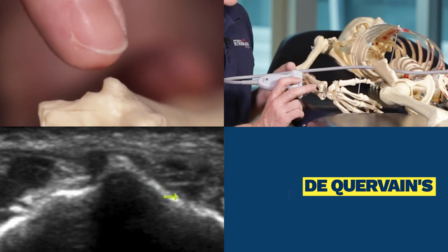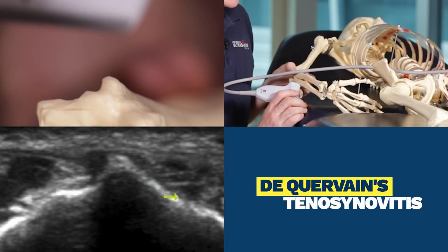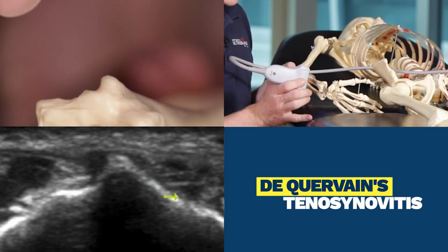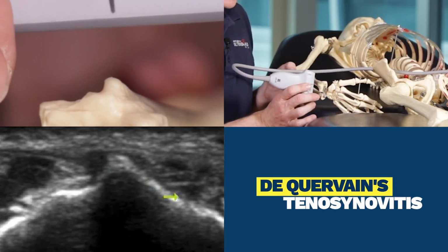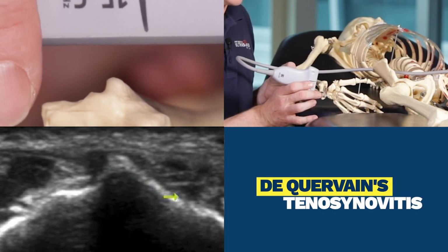The landmark is going to be Lister's tubercle, which is this bony prominence on the dorsal radius. The orientation of the probe is going to be short axis or cross section on the distal forearm with Lister's tubercle in the center of the screen.